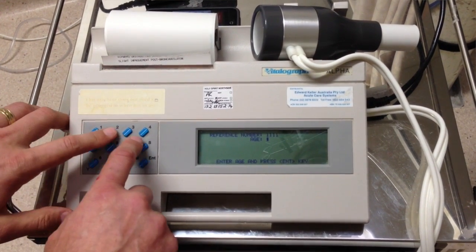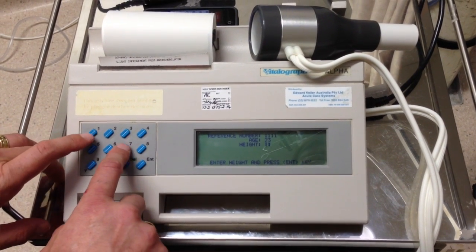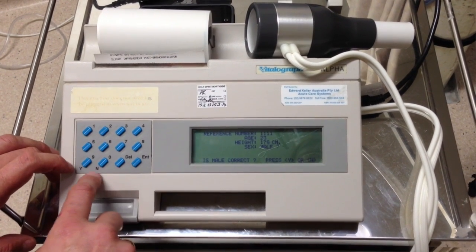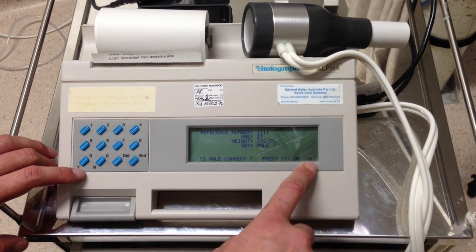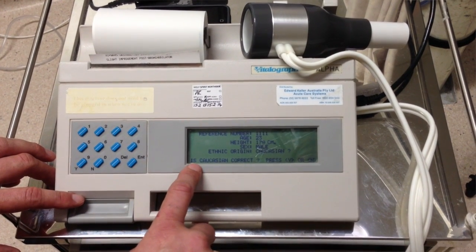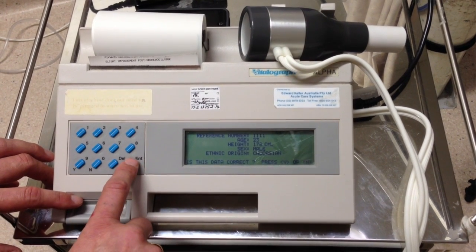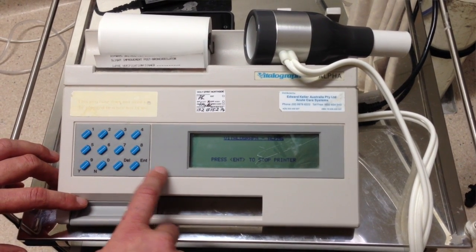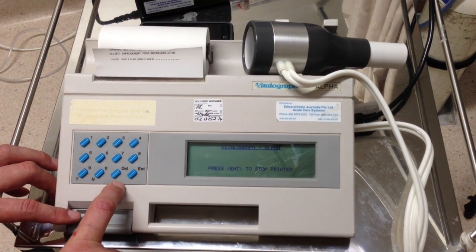Ask the patient's age — 23, Derek? Put in the patient's height. Then it'll ask for their gender; it comes up with 'male query, yes or no.' So if it's male, press yes; if it's female, press no. Then ethnic origin — Caucasian — so I'll put yes. Then 'is this data correct?' — yes it is, press yes. To skip printing, press the enter button because it takes forever to print.